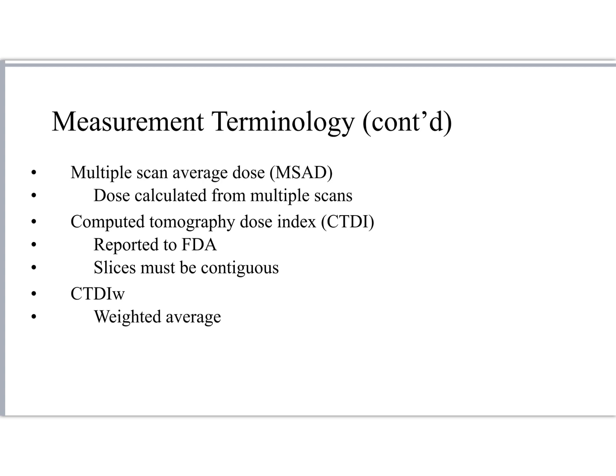So what is this doing? Well, the CTDI is actually taking some liberties with its calculations. For example, if we look on page 174, CTDI can only be calculated if slices are contiguous. That would mean that they would basically have a pitch of 1. So there need to be no overlap or gaps between the slices. So we just take the CTDI, it's multiplied by the ratio of slice thickness to slice increment, in other words, the pitch, and we have a calculation of how that dose is distributed over a volume of tissue, right?